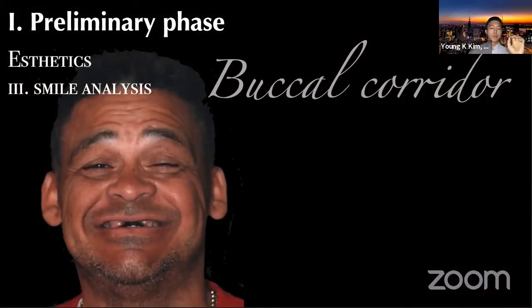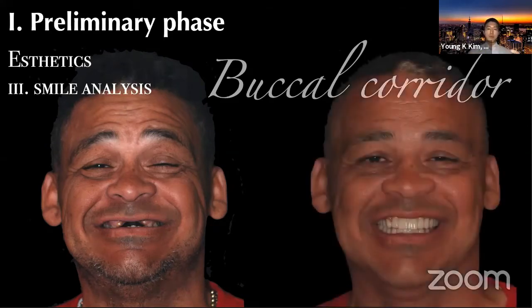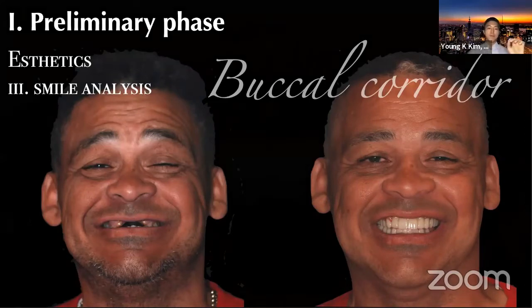So if you don't know that aspect at the beginning, then again, you can't really treat this patient while picturing the final look. This patient is in the temporary phase. It's a full mouth maxillomandibular prep and temp case. And then we deliver the middle temporary here. So again, the fullness of the smile is critical.